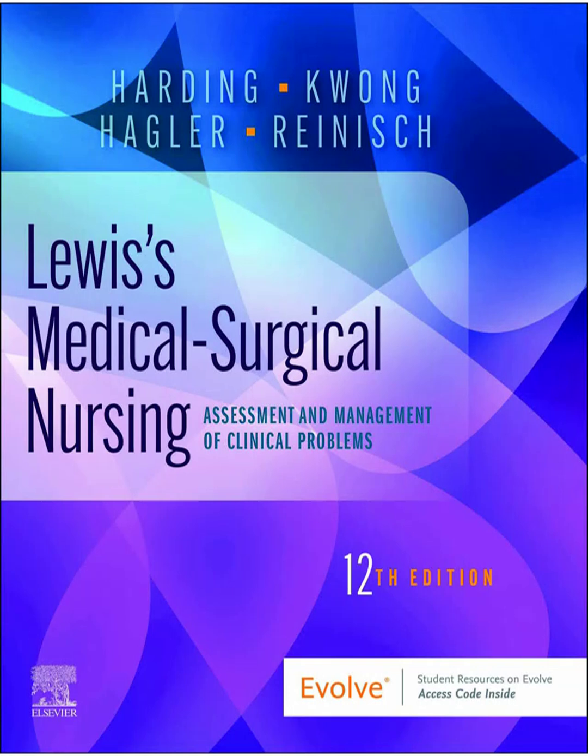So what's the first nursing action? Always check the patient first. Are they okay? Then check your equipment. Are the leads on securely? Good skin contact. Maybe change the patches. Address any patient movement if you can. Rule out artifact before you jump to diagnosing a weird rhythm. Good point. Check the simple stuff first.